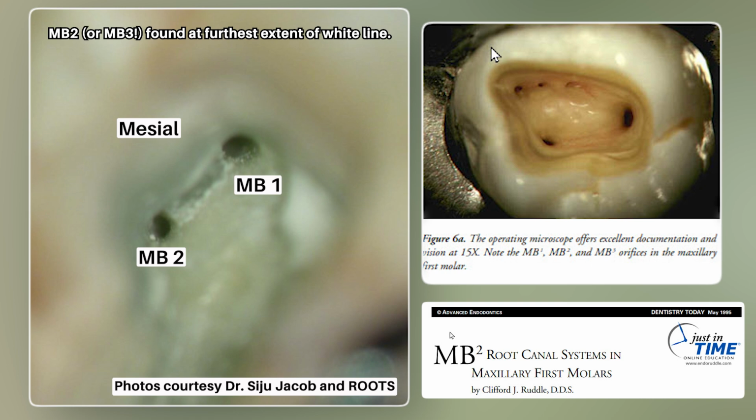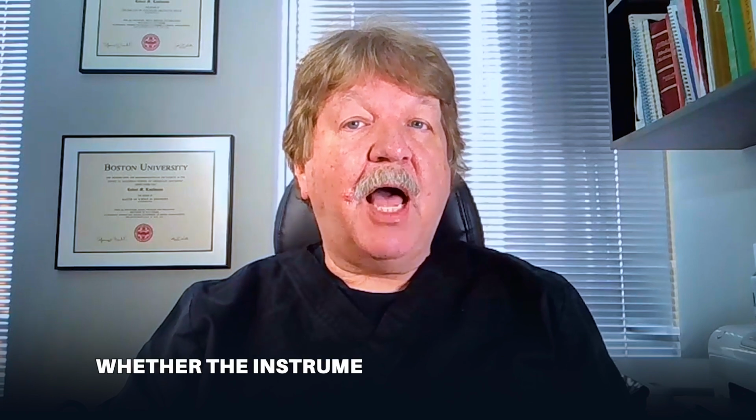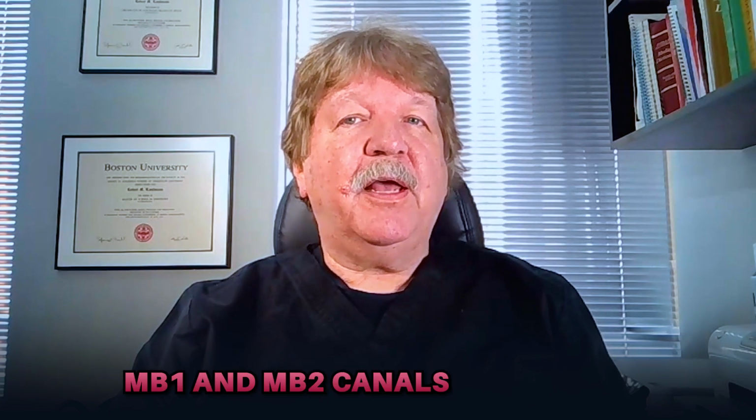By doing this, you'll note that the initial negotiating instruments such as a 6 or 8 file will begin to stand more vertically, rather than needing to be finessed and guided from the distal aspect of the access into the orifice. Special note should also be made of how close the MB2 orifice is to MB1, and whether the instrument glide path seems to be pointing the file in the direction of MB1. Both are indications that there is a high possibility that the MB1 and MB2 canals are joined.